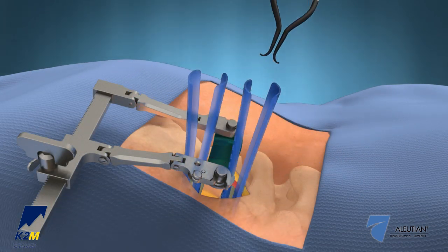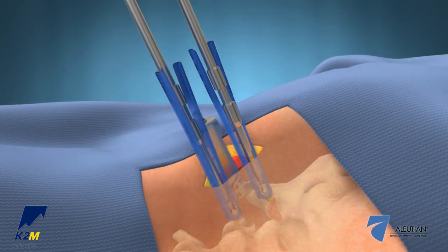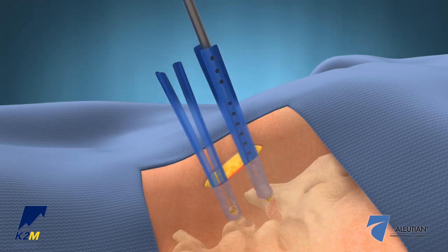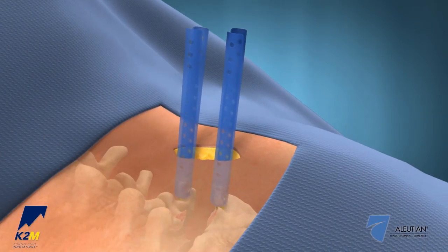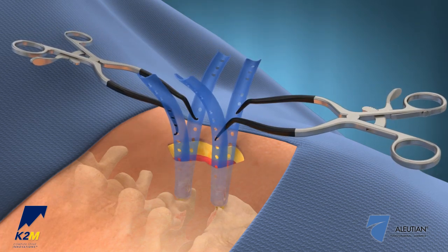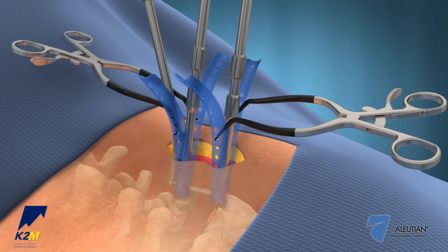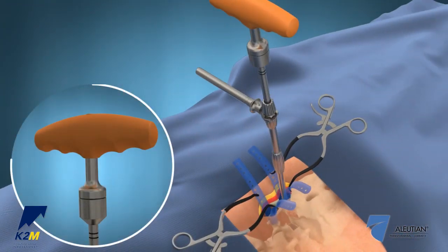Remove the Gelpy retractors and TerraNova frame assembly. Retrieve the set screws from the screw housings to release the retractor-distractor blade. Use the MI head adjuster to realign the screw heads and Serengeti retractors, and then place the Gelpy retractors in the proper position to prepare for rod insertion. Place the rod in the screw heads through the Serengeti retractors and lock it into position using the set screws. Compression and final tightening can then be performed.